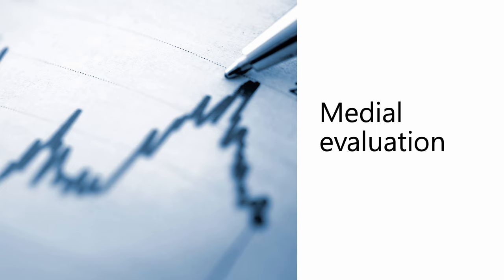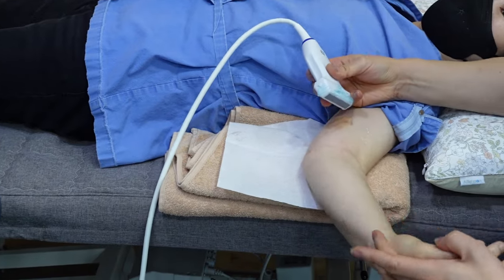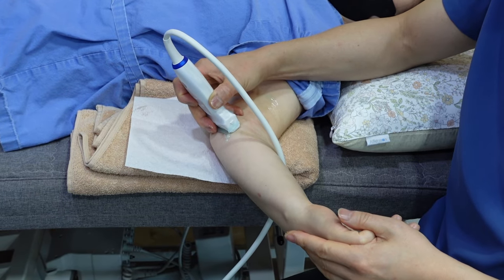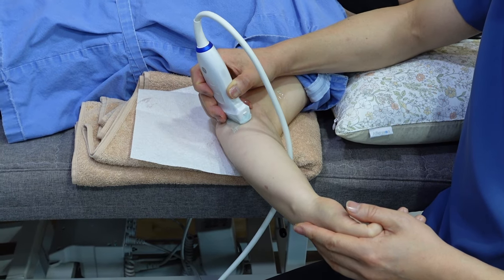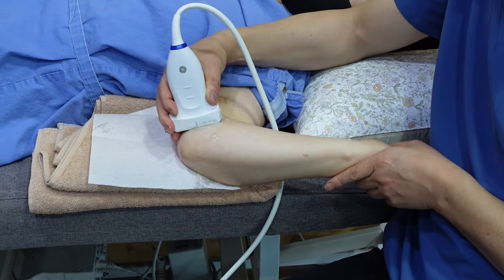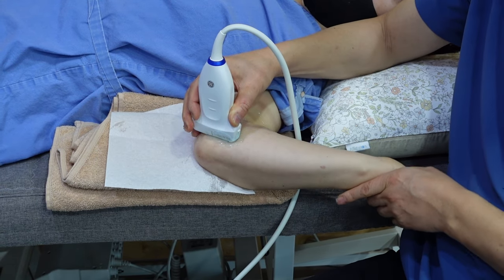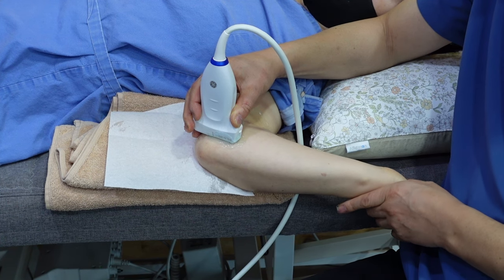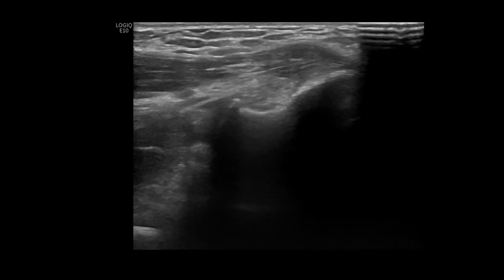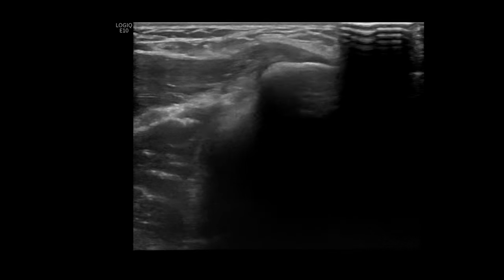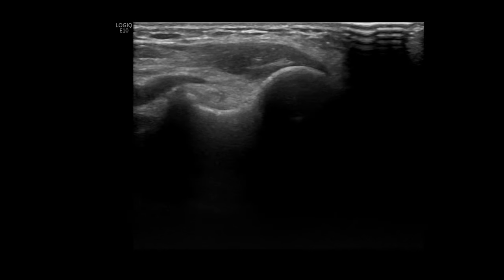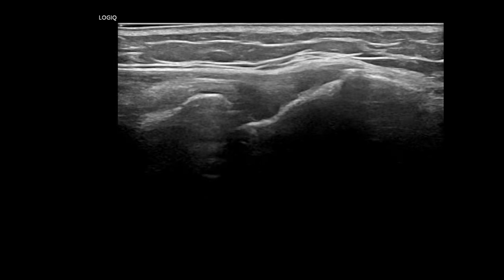For medial evaluation, the patient is positioned supine with the shoulder slightly abducted and externally rotated and the forearm externally rotated. An extended elbow position is preferred while evaluating the common flexor tendon, but a 90-degree flexion view is more suitable for assessing the medial collateral ligament. Dynamic scanning with valgus stress, demonstrating joint space widening, can benefit partial ligamentous tears where the ligament is intact but lax. Using coronal planes and placing the cranial edge of the transducer over the medial epicondyle, the common flexor tendon is visualized on its long axis. This tendon is shorter and thicker compared to the common extensor tendon, and the anterior bundle of the medial collateral ligament should be checked beneath it.